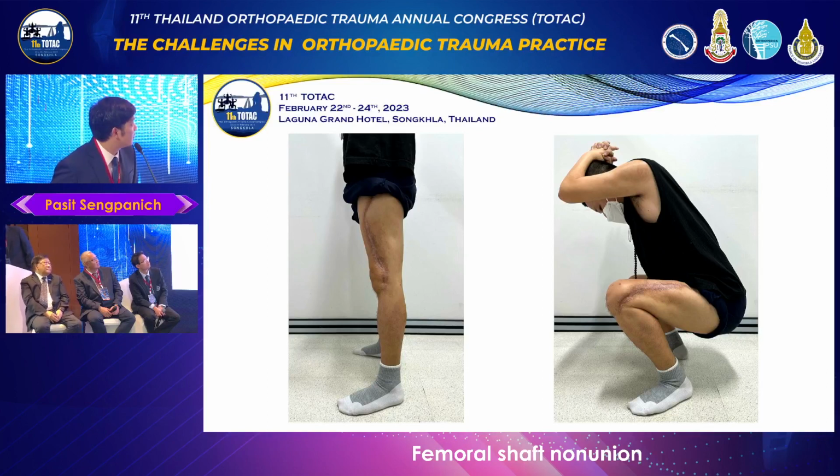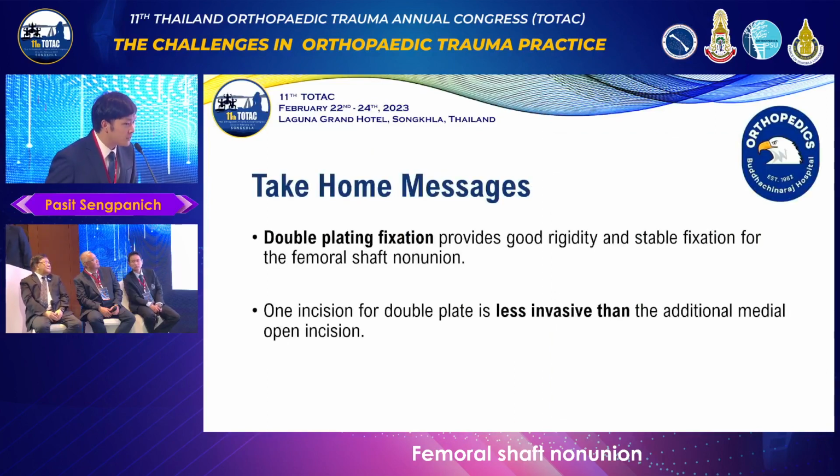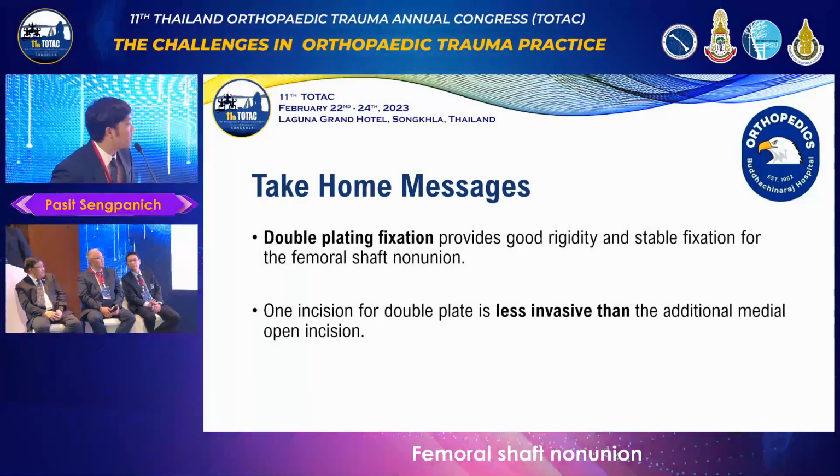That is all. The take-home message is that double plate fixation provides good stability and stable fixation for femoral shaft non-union when the femoral canal is narrow, and the one incision for the double plate is less invasive than the additional medial open incision.